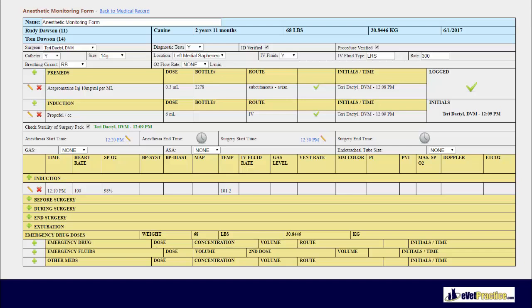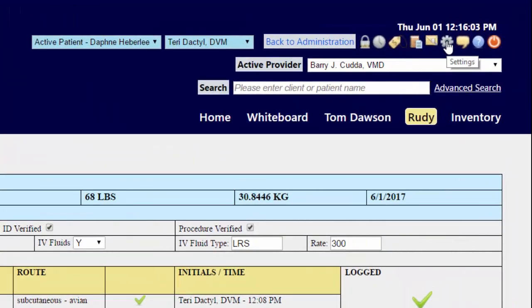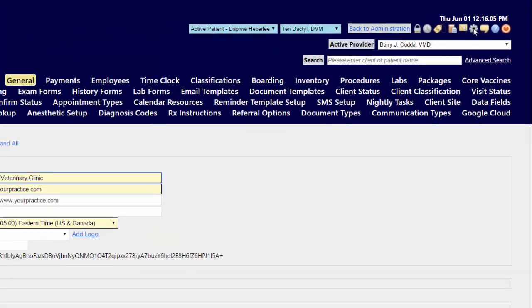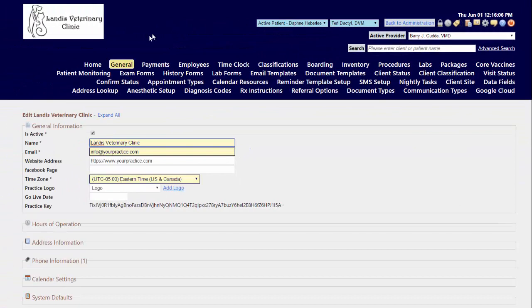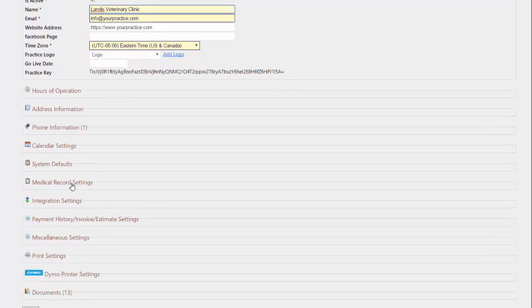To use the anesthetic monitoring form feature you must first make sure it is enabled on your site. To enable this feature, navigate to the gear icon to take you to the configuration side of the system and on your general tab scroll down to the medical record settings section and expand it out.